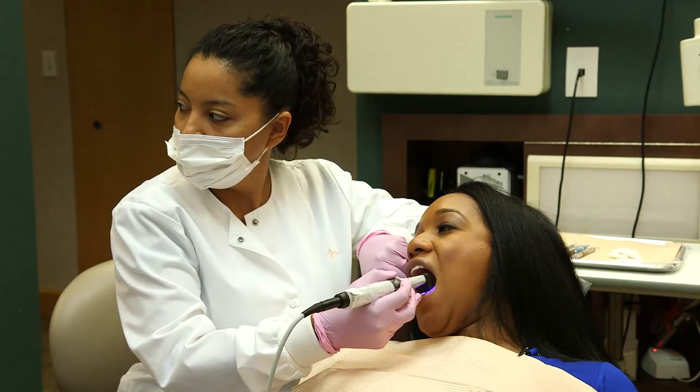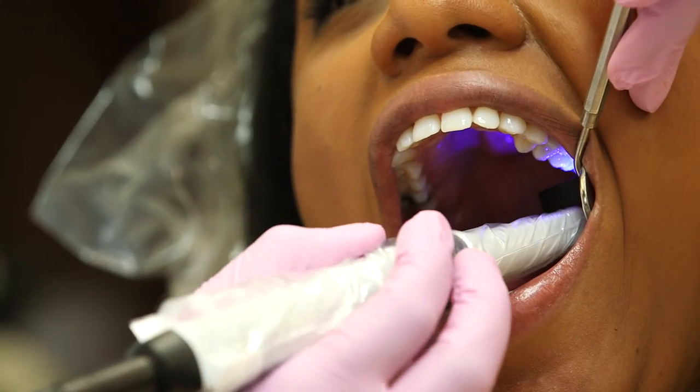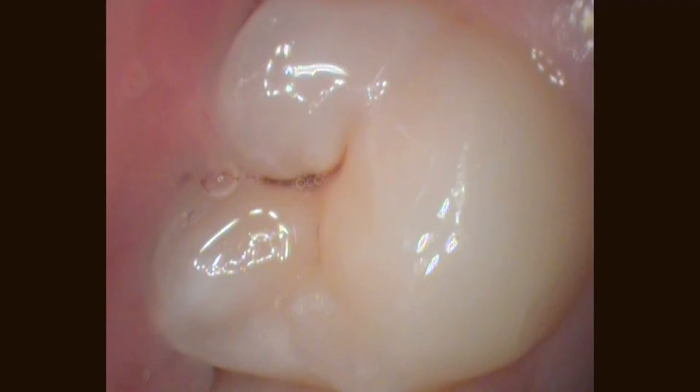Now Spectra will be used to scan each tooth looking for any decay or excess tartar and plaque. The camera is simply placed on the tooth and the image is captured. This is done around the entire mouth very easily and quickly. On this particular tooth I can see that there is something there, so we go ahead and capture an image. We can see a numerical value show up over a colorful diagnostic image.